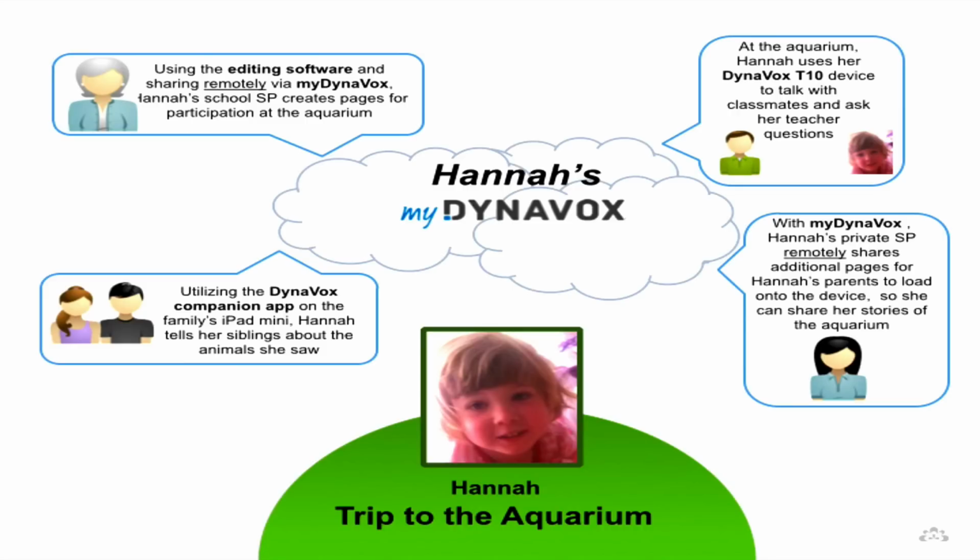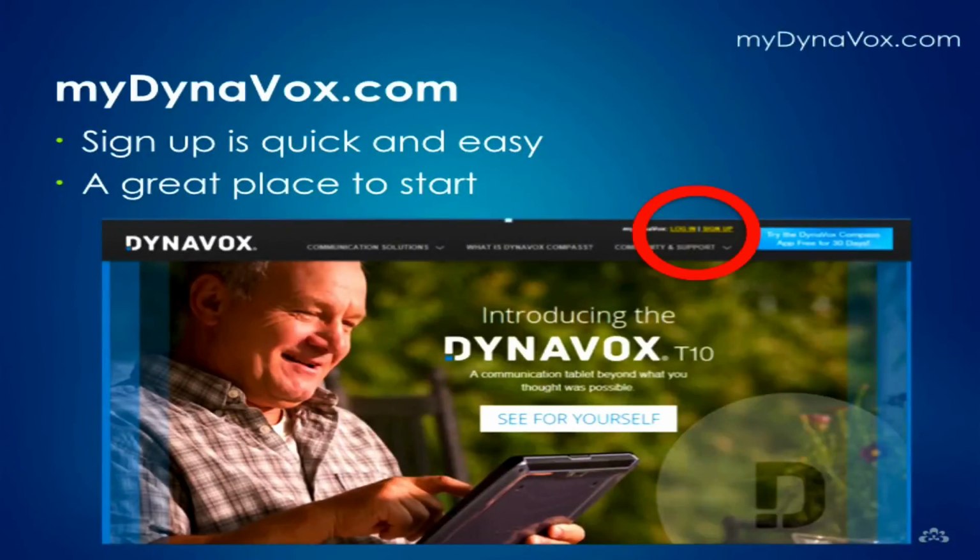Because she has a T10, she also can have the app on her iPad mini. So family can model using the communication pages with Hannah as she's learning language. And her siblings can do that also. So they can all talk to each other using the T10 and the companion app on the iPad mini. So that's just an example of some different ways that a student might use the Compass app and MyDynavox, in an example of the aquarium.